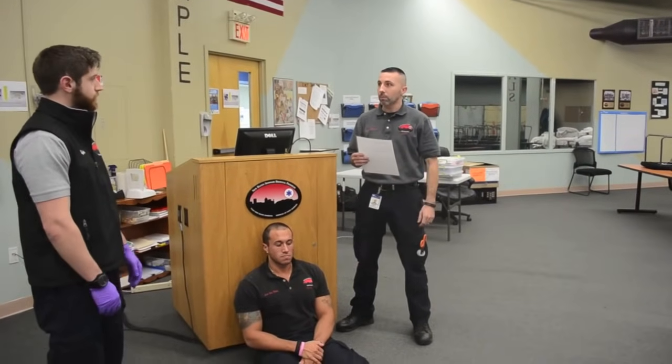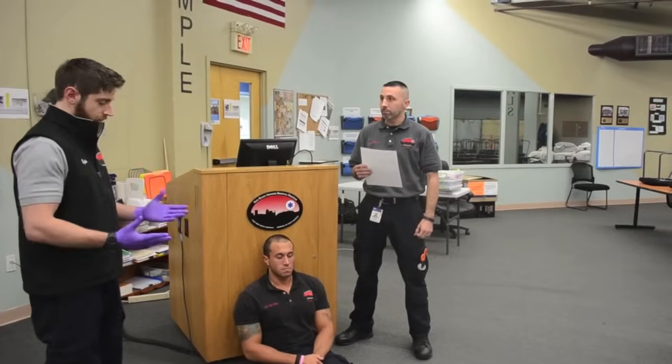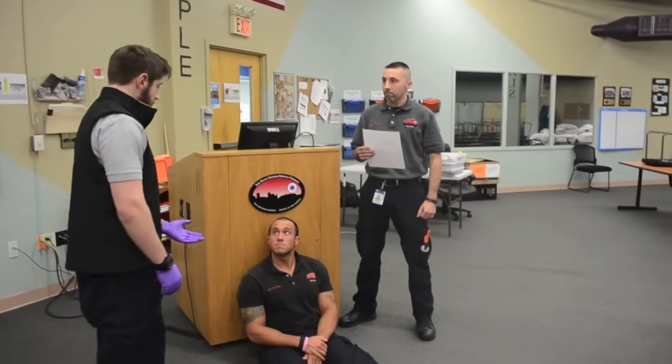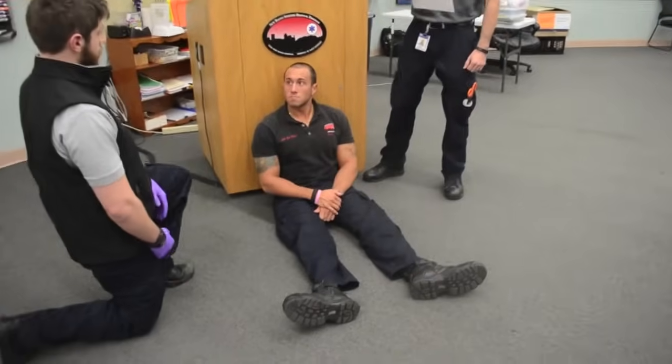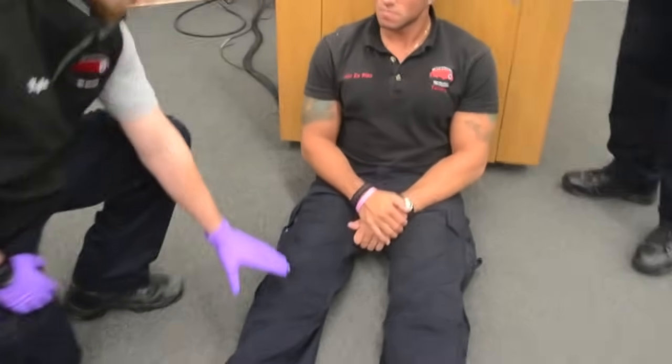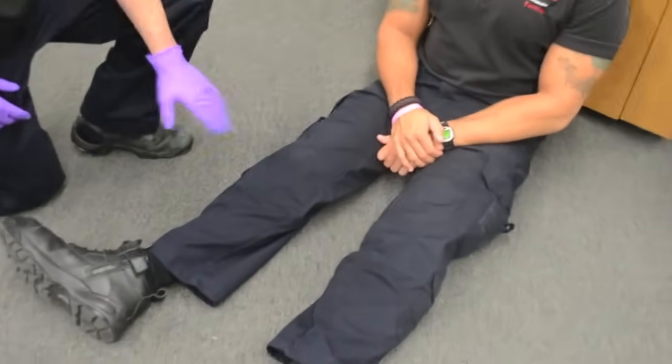Just making sure that my scene is safe. Your scene is safe. And I have my BSI on. I am going to approach my patient and introduce myself. Sir, my name is Kyle. I am here to help you. Just making sure this is the injured extremity, the right side.